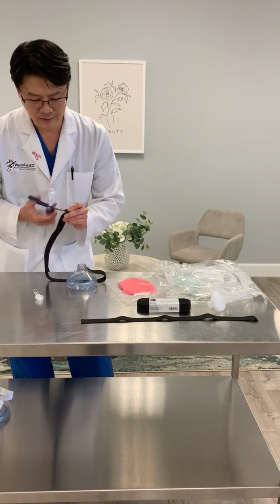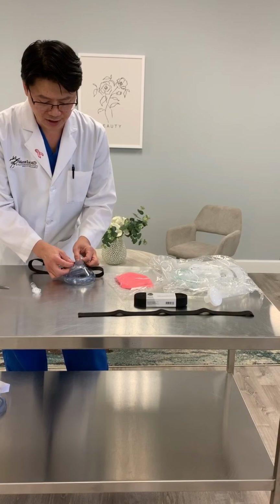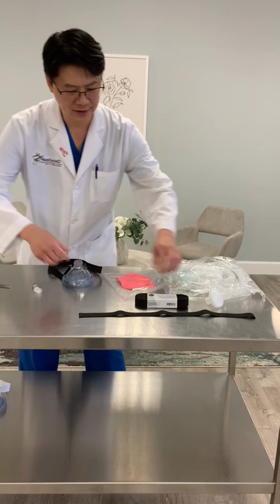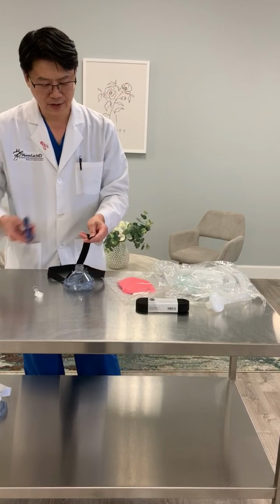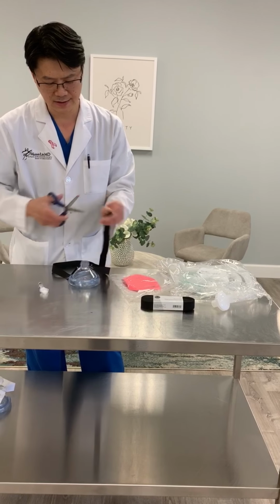This is kind of like a belt where you can have multiple holes, so you can adjust as needed. So that's the upper band. That's a little bit longer, and then I would proceed with the bottom elastic band.